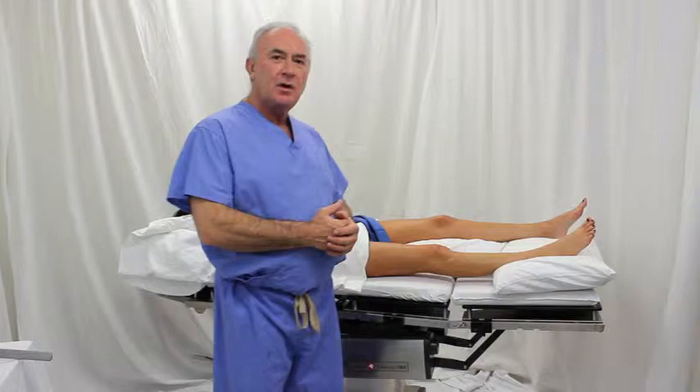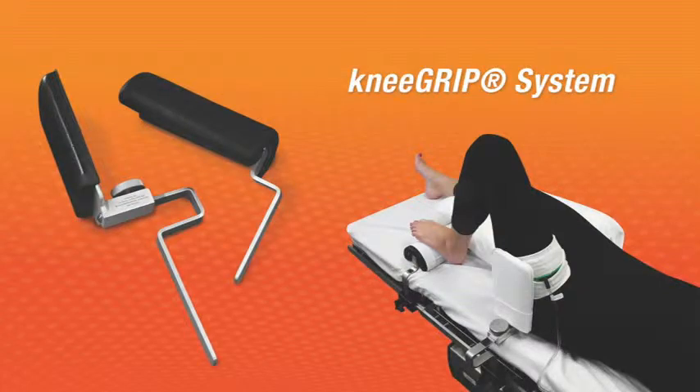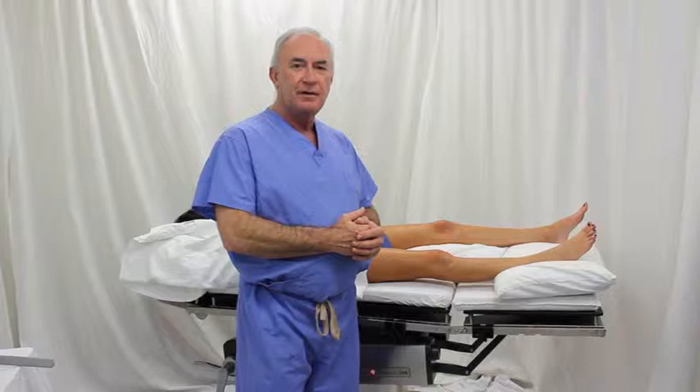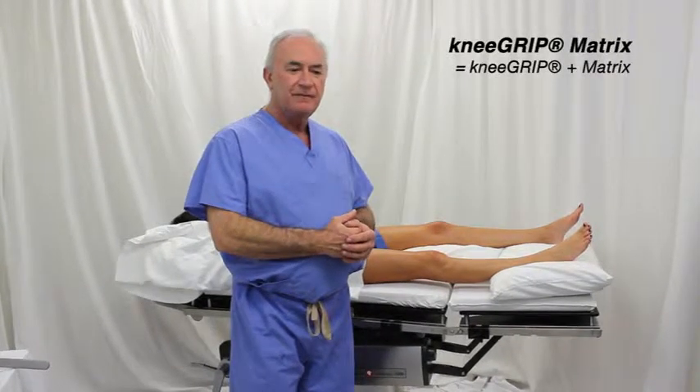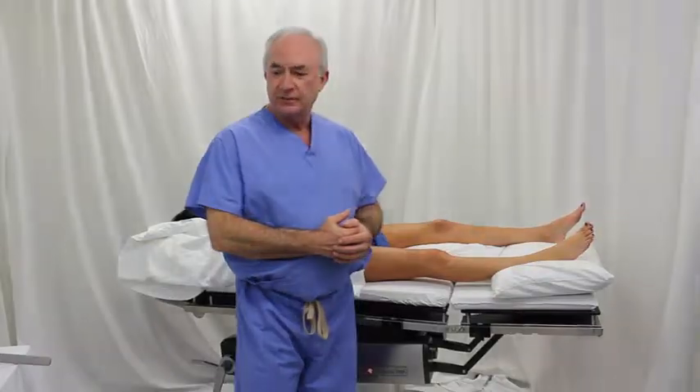A lot of you are probably familiar with the knee grip. It's commonly used for knee replacements. This device is used in conjunction with the knee grip and it has a lot of very fine features, and we will demonstrate how to use it and these particular features.